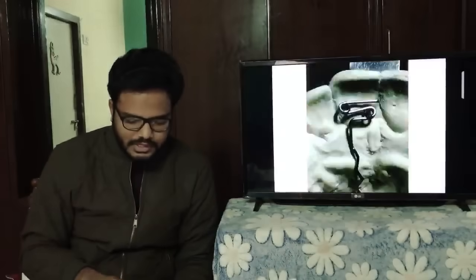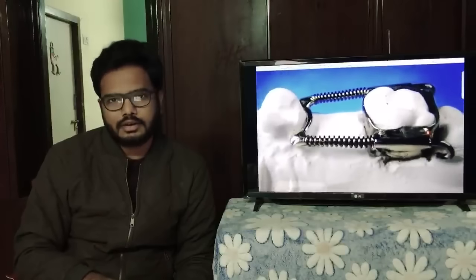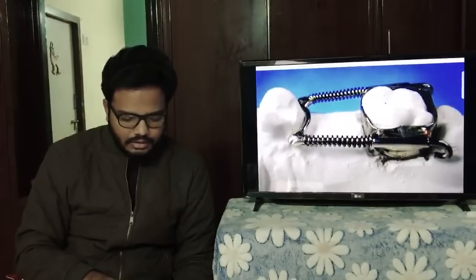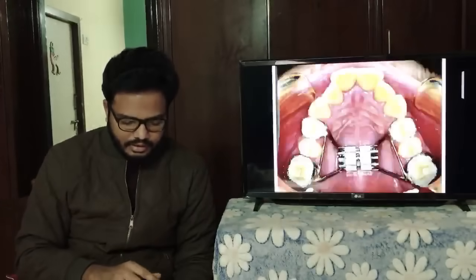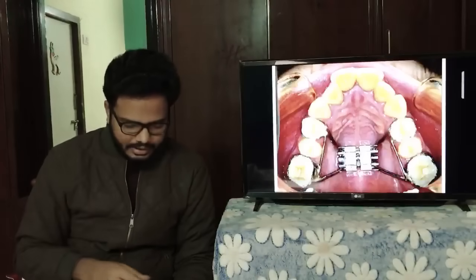Fine. So we have one general image. Before I post the general image, I'll go through the names of appliances really quickly, in case you're coming to the session late. So this is Gerber's Space Regainer. You can see the band, U-shaped rod, coil spring, Gerber Space Regainer. And this is the Hyrax appliance, Hygienic Rapid Expander, Hyrax.